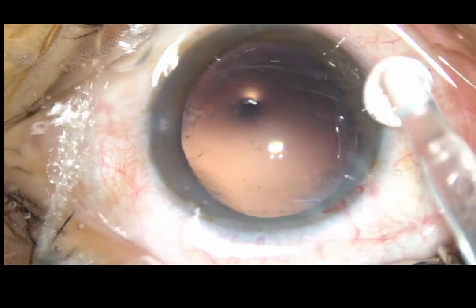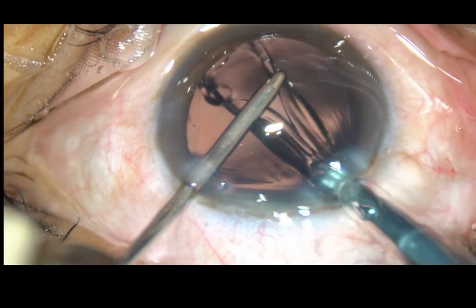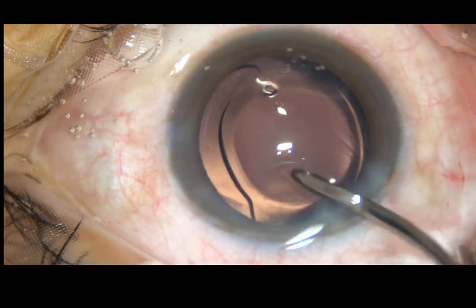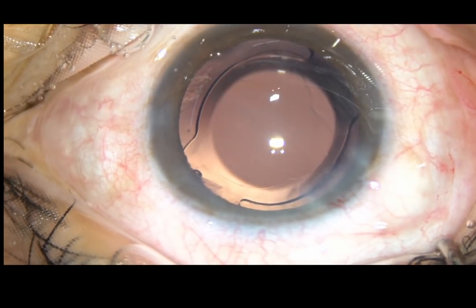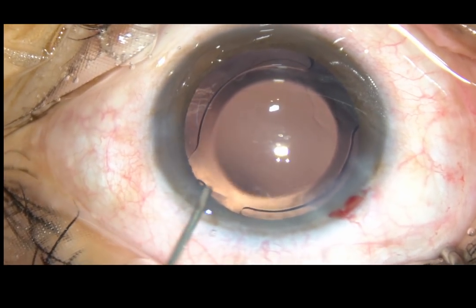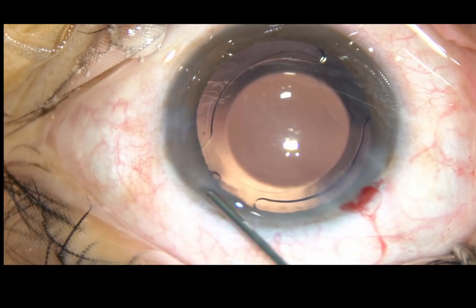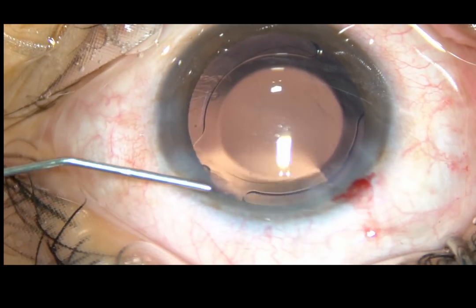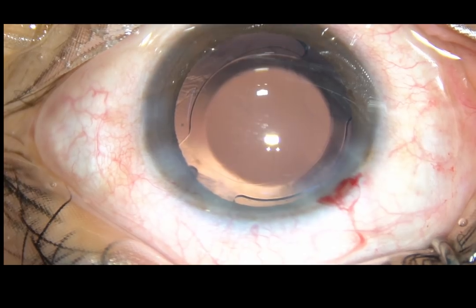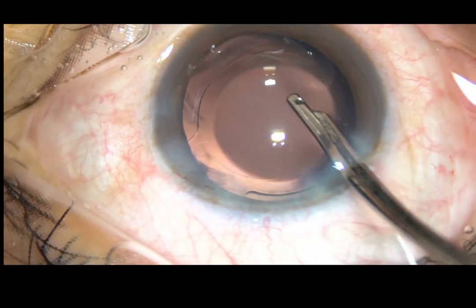A hydrophilic acrylic intraocular lens is implanted in the capsular bag. Dear colleagues, this is a totally unedited video and you are watching it just like live surgery. The lens is in the capsular bag. Now, a bit of moxifloxacin is injected. The only one side port that has been made in this case is being hydrated with BSS, and this stab wound becomes waterproof.